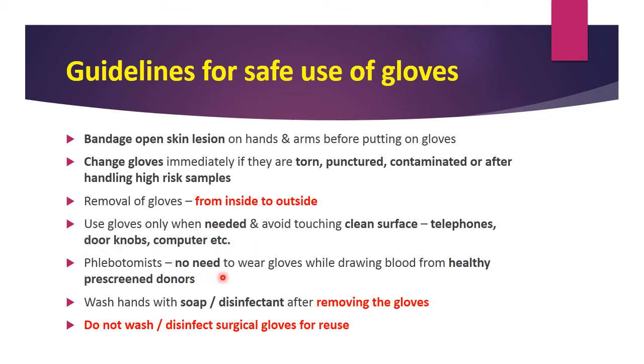A phlebotomist may not wear gloves if handling healthy pre-screened donors. So there is no need to wear gloves with respect to pre-screened donors, but for your safety you have to wear gloves. Wash hands with soap or disinfectant after removing the gloves. After removing gloves also you have to wash your hands with soap or disinfectant.